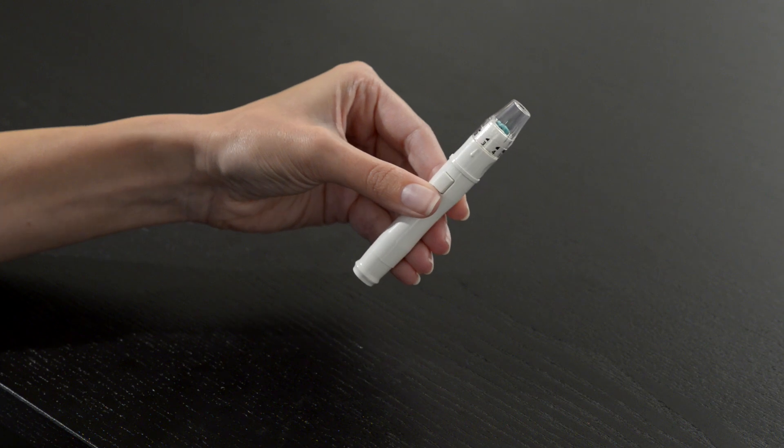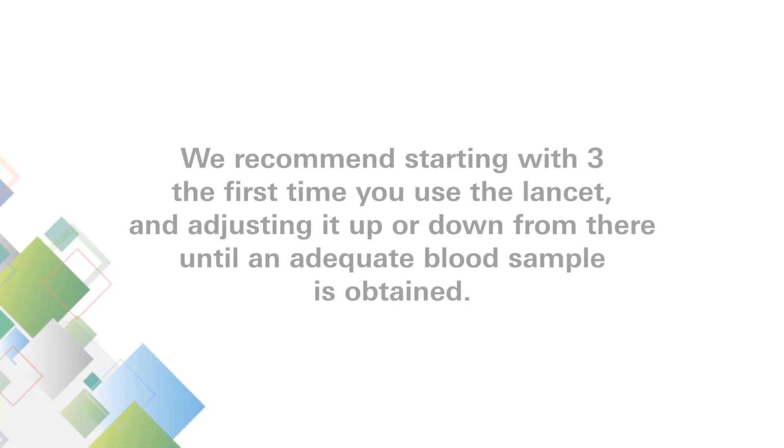Select the puncture depth of the lancet. We recommend starting with three the first time you use the lancet and adjusting it up or down from there until an adequate blood sample is obtained.